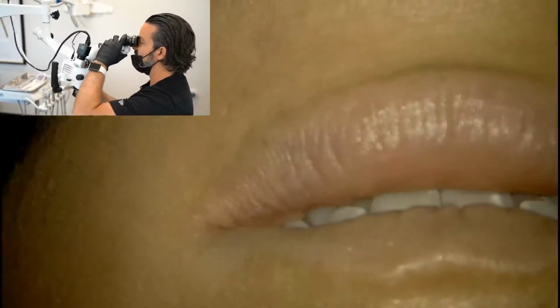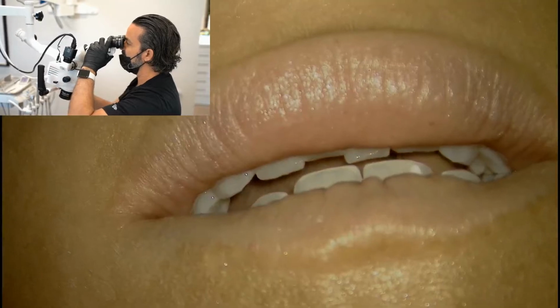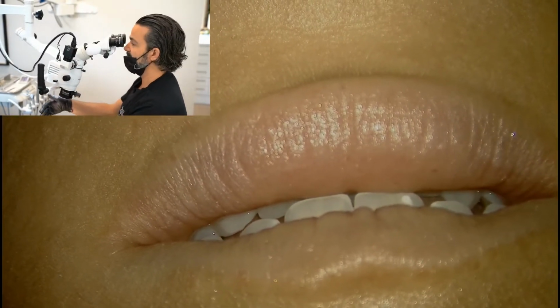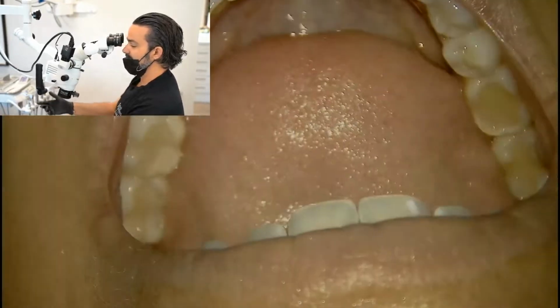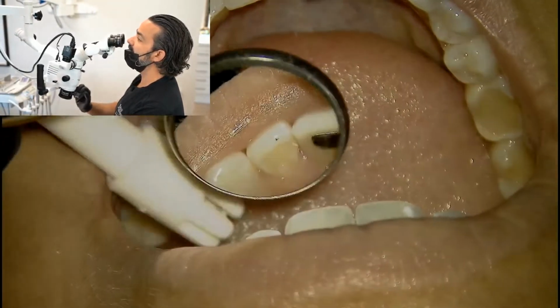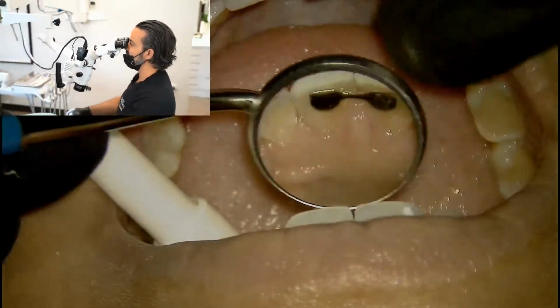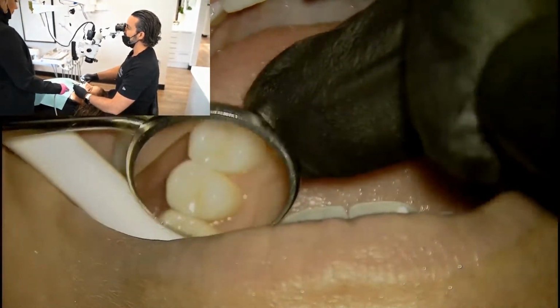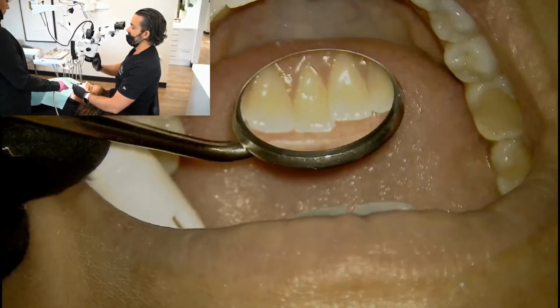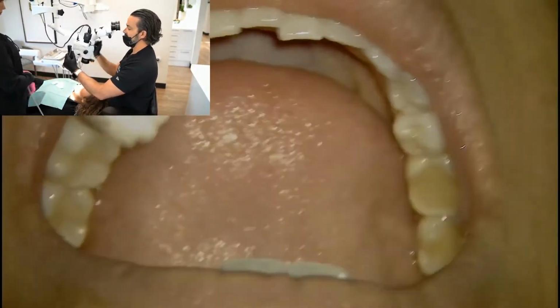But when I'm in 12 o'clock, especially as an endodontist where everything mostly is occlusal access or lingual, I just use my mirror and I can come in the same position, whether I'm looking at the maxillary or the mandibular arch. So let's get me back corrected.